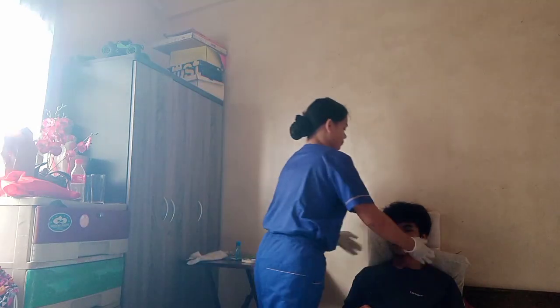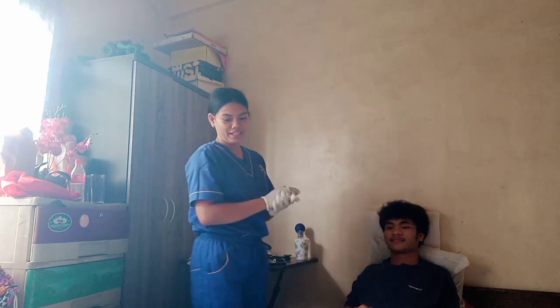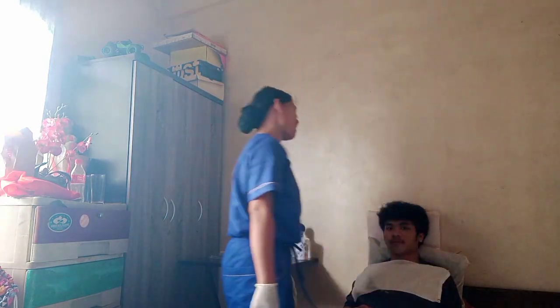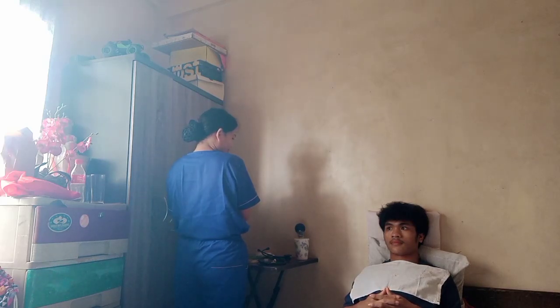And after that, prepare all the equipment and position the client. Then after that, place a towel on the client's chest. Then after that, select the appropriate size of the insertion tube.